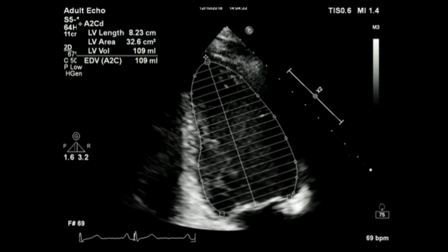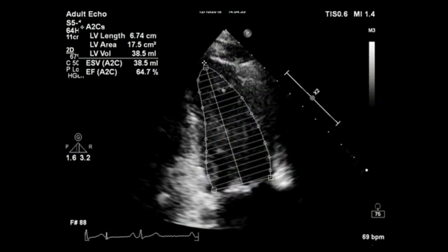Now you can assess the left ventricular volume. Trace the endocardial border to obtain the left ventricular end-diastolic volume — this measurement needs to be obtained from the apical 4 chamber and 2 chamber views in order to obtain the ejection fraction by Simpson's biplane method. Now trace the endocardial border in systole to obtain the left ventricular end-systolic volume. Remember to exclude papillary muscles and trabeculations and to index the measurements to body surface area.